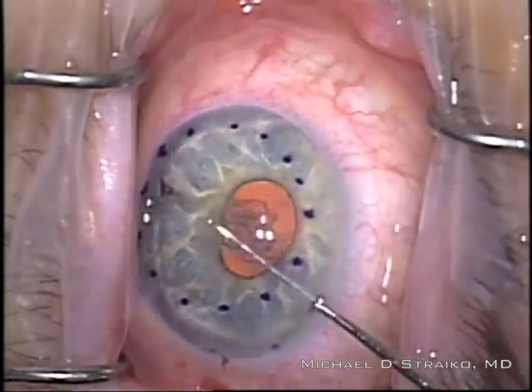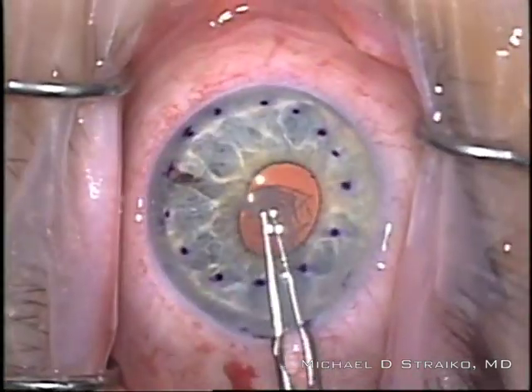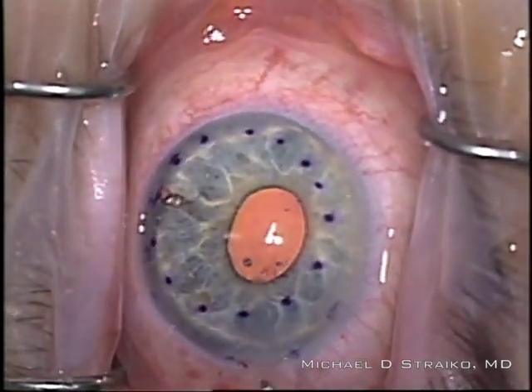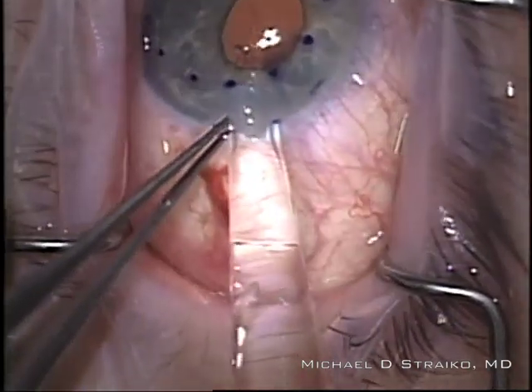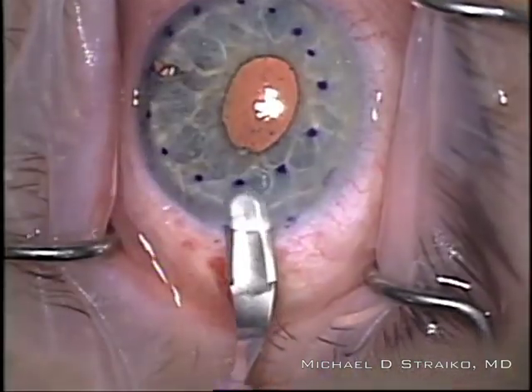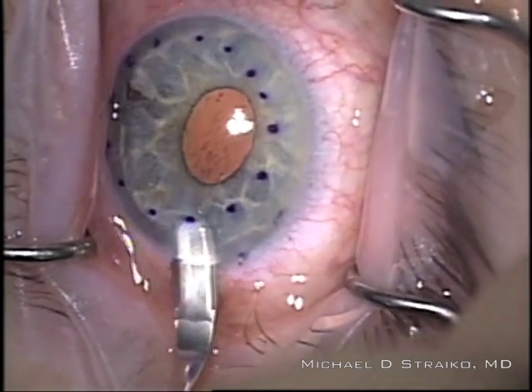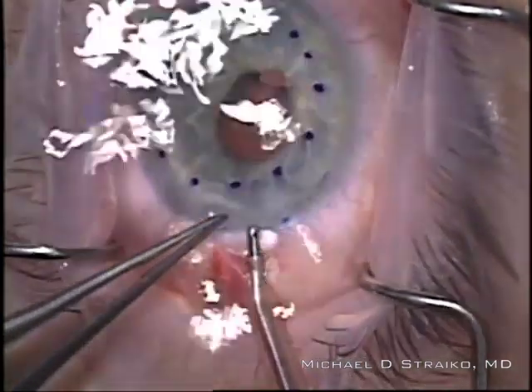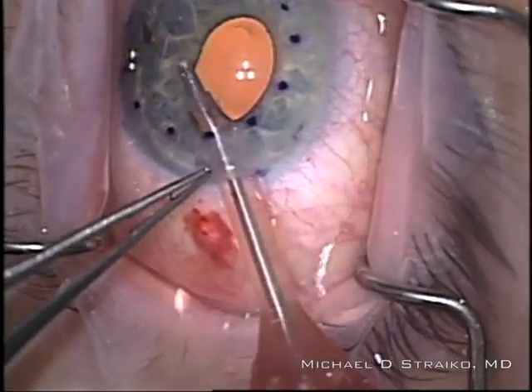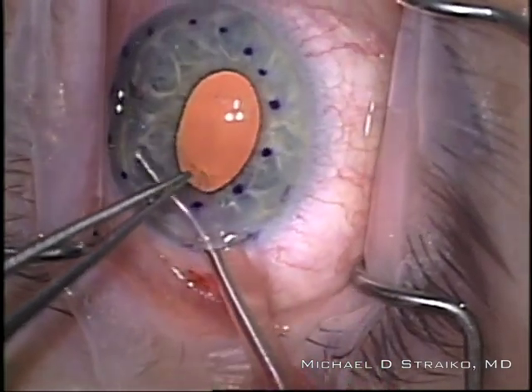It's really easier to see with the red reflex behind it. I'm just giving it a swirl, making sure it's all disconnected, and removing it with a pair of forceps. Now I'm testing to make sure that my glass Jones tube is going to fit for the graft insertion. It was a little tight, so I just enlarged the wound slightly with a crescent that's about 3.2 millimeters in width. The Jones tubes can vary slightly, so it is important to check your fit.